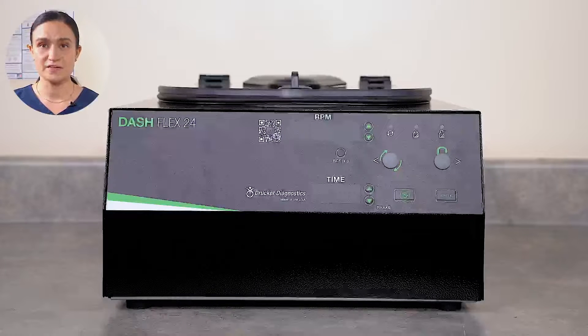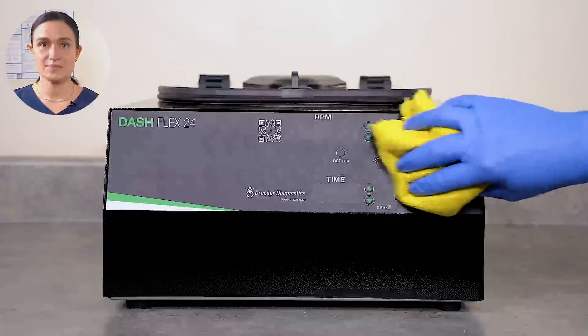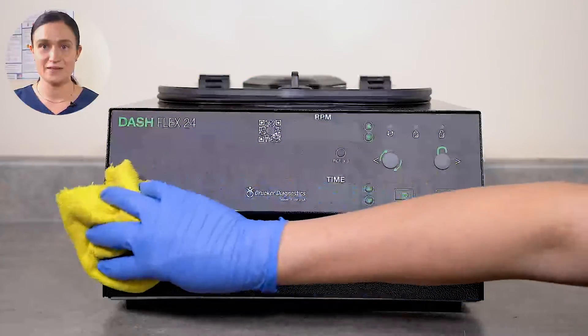Dry your DashFlex 24 immediately after finishing cleaning and disinfecting, and then be sure it's plugged in and turned on so it's ready for the next use.